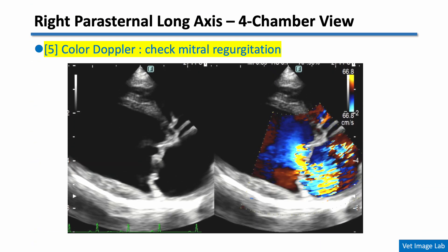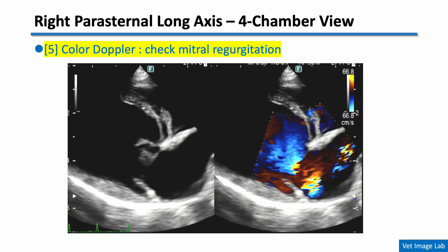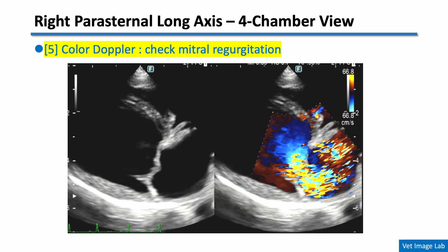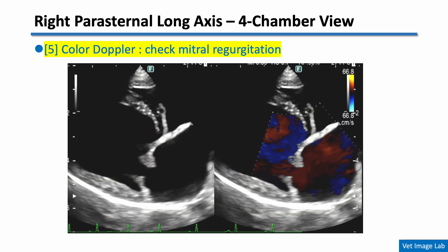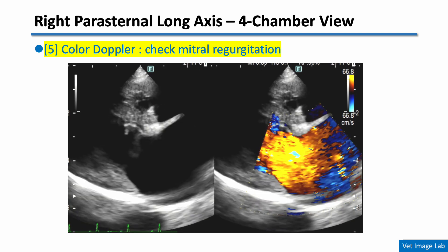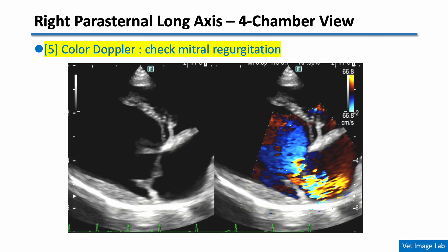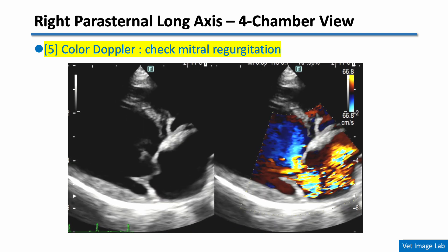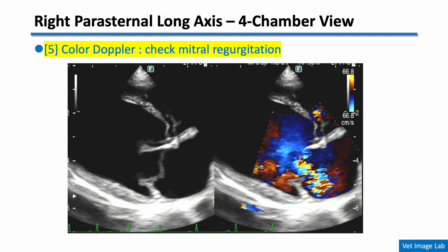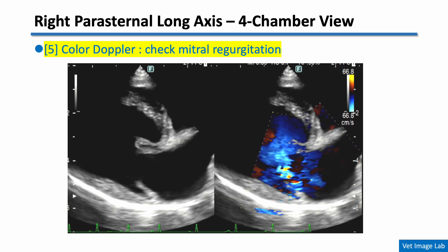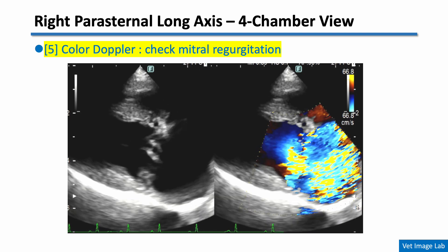Finally, in this four-chamber view, we use color Doppler to check for mitral regurgitation. The mosaic flow pattern with multiple colors indicates turbulent blood leaking backward into the left atrium during systole. The presence, direction, and extent of this color jet help estimate the severity of mitral regurgitation. We'll discuss this further in the left apical view in more detail.